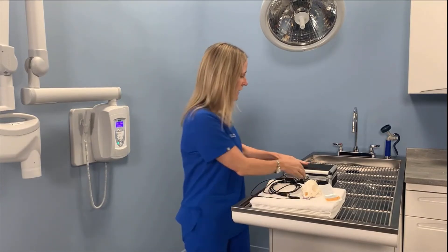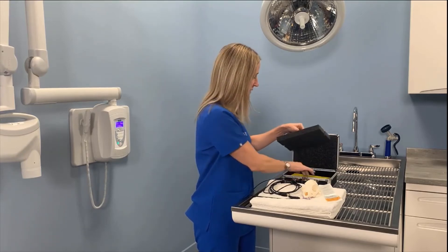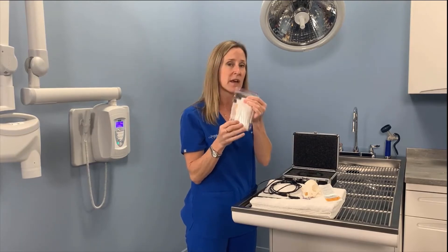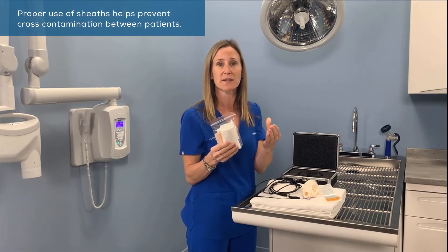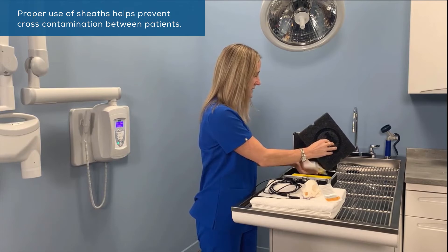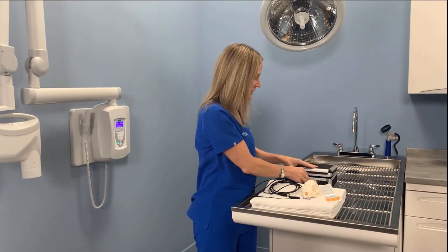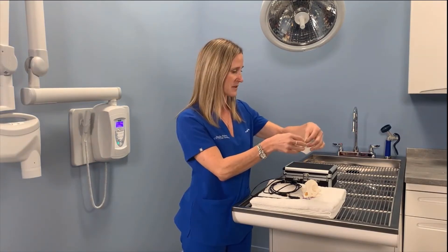It's going to come inside this case right here. When you open it up and lift the top piece of Styrofoam, underneath you're going to find a package of sensor sheets. These you're going to use for each new patient to protect the sensor from cross-contamination. I suggest you find a space nearby where you're doing procedures to keep these handy, and put a new sheath on for every new patient that you do dental x-ray procedures on.